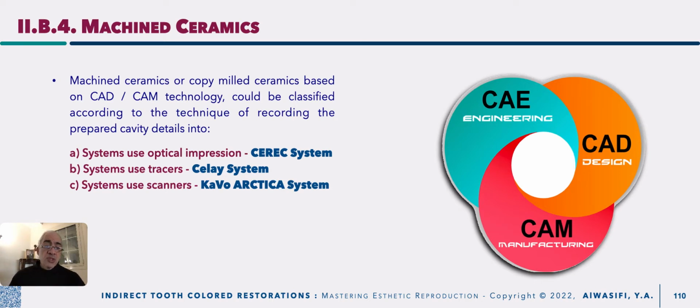Most commonly used now are the design is generated by digital systems, which is CADCAM or based on CADCAM technology, which is the acronym of computer aided design, computer aided manufacture. Considering this item, especially CADCAM, and how it is introduced into dentistry, and now it is a great branch called digital dentistry that needs to be much more further discussed in full details.